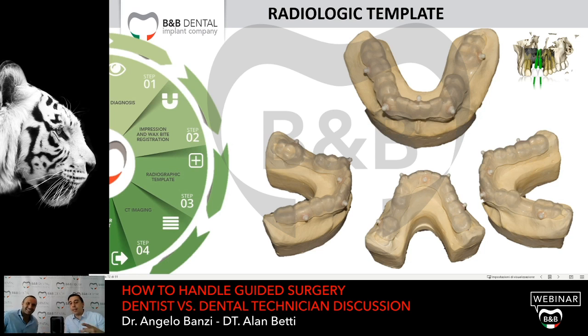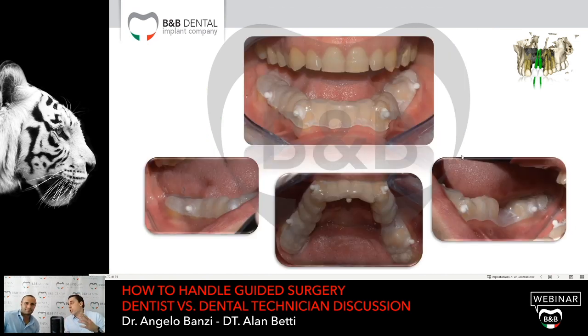He's very young, and he doesn't have metal in his mouth, and there isn't just one tooth. If I remember well, we didn't use the radiological template because it wasn't necessary. We performed the CBCT with the radiological template, but we didn't match the radiological template. What he did was match just by teeth.